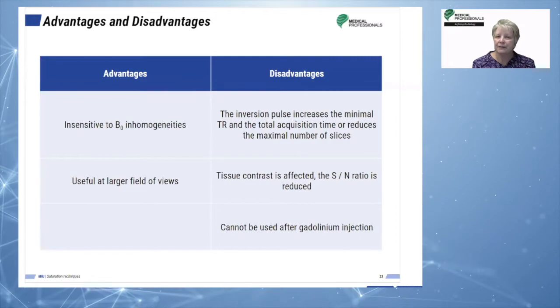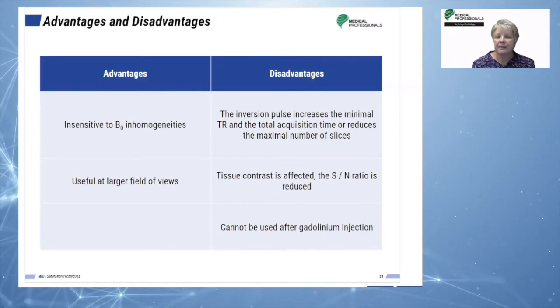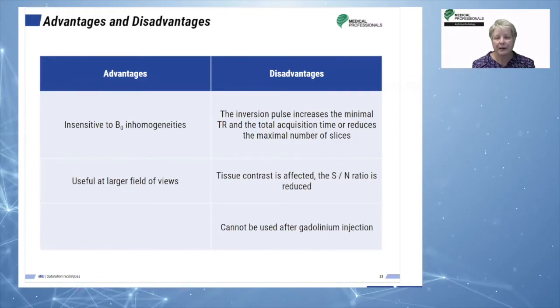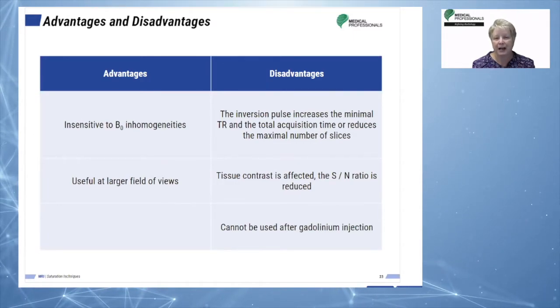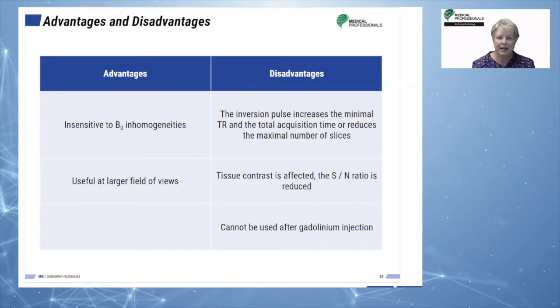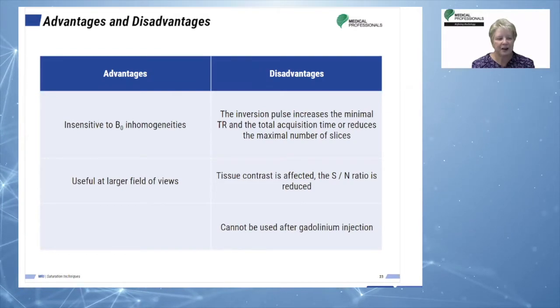Another important disadvantage is that it is not useful for post-gadolinium injections because of the effect gadolinium has on T1 relaxation. I'm not saying it's never used for that, it's just not always the best.